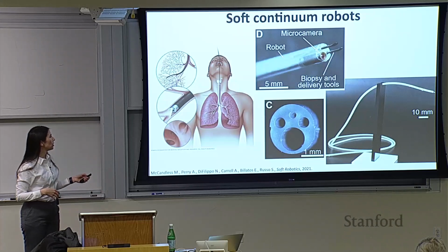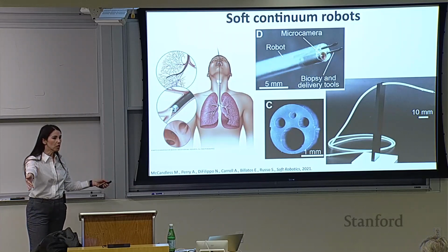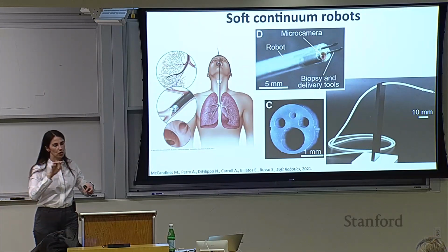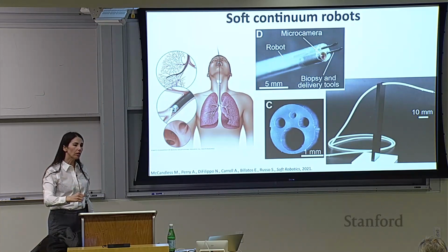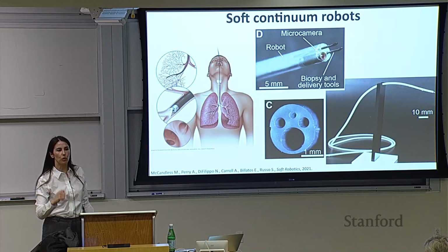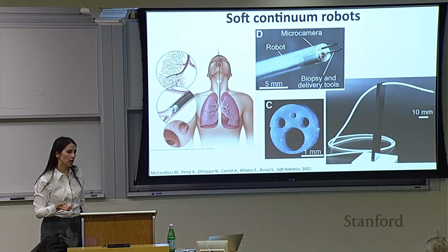With traditional bronchoscopes, you can reach what are called generations. Every time you have a bifurcation, you call it a generation. You would probably be able to reach 2 or 3 generations. And then you have to deploy tools without direct vision guidance from the camera, but under X-ray screening and navigation. If you push further, sometimes you can, but it has been shown that the stress you apply onto the tissue is way too high. So post-procedure, patients typically have complications, tissue trauma, bleeding and scarring. And again, it's not ideal when you have a person that already has lung cancer, right? You don't want to go that way.